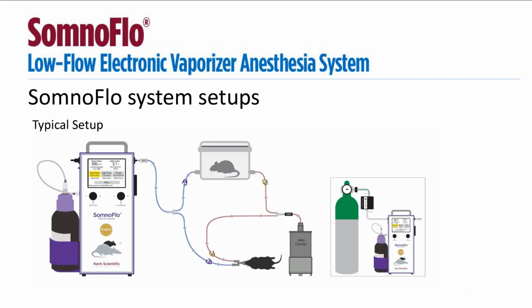All right, so hope you enjoyed that video. Okay, so now I will take you through some various SomnoFlow setups.